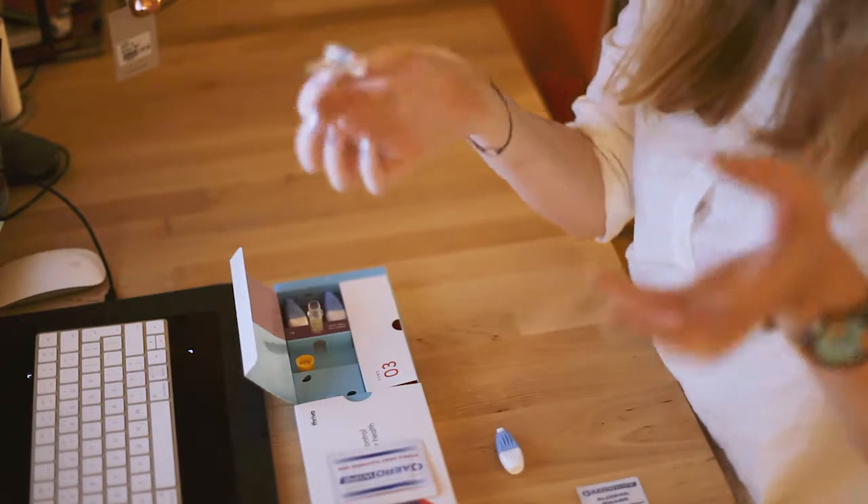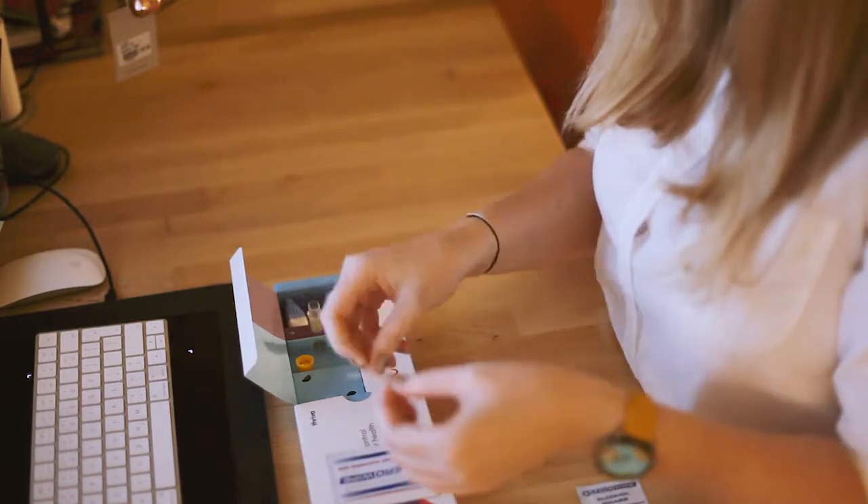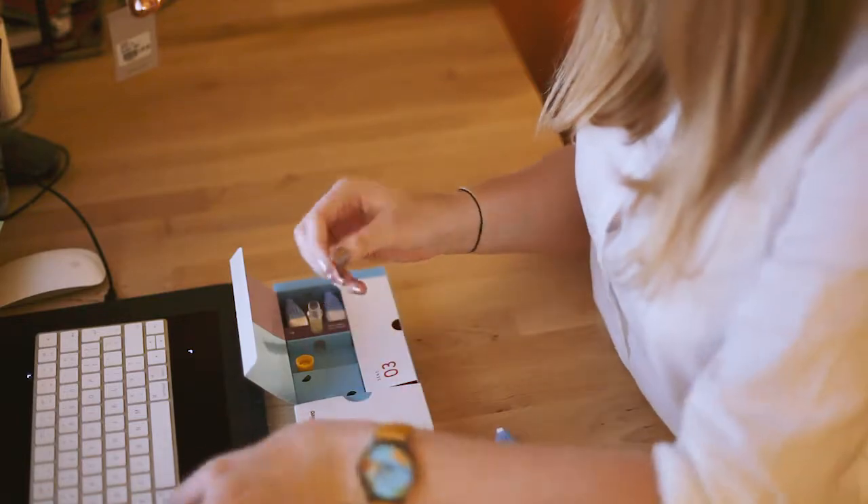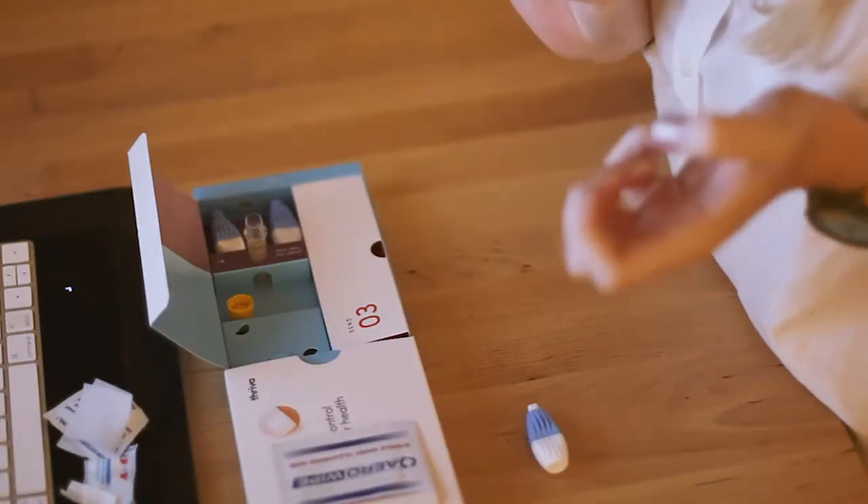This should be really cool — I'm looking forward to you seeing me freak out. See you in a second. Alright, so my hands are clean and warm for the most part. I've got to prepare my plaster. I don't want to do it.